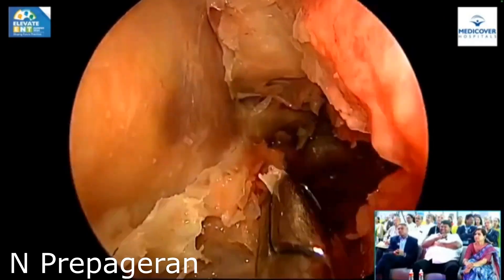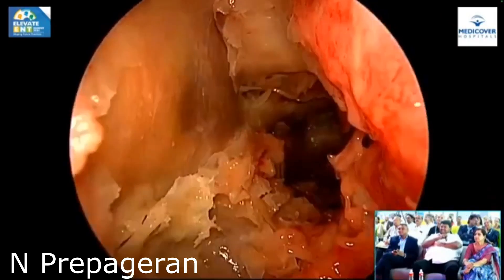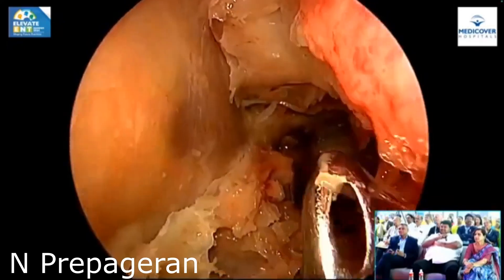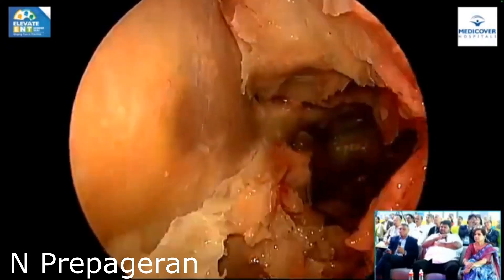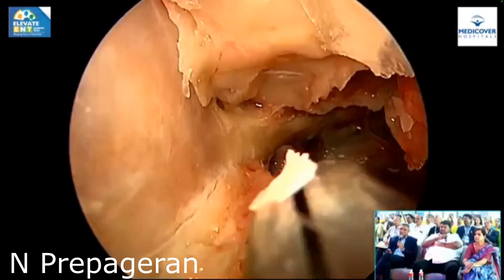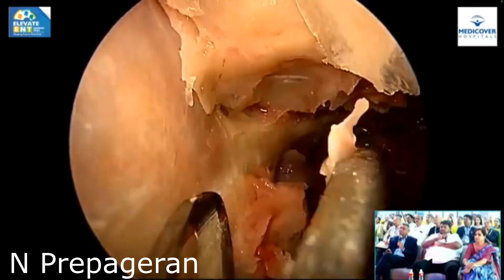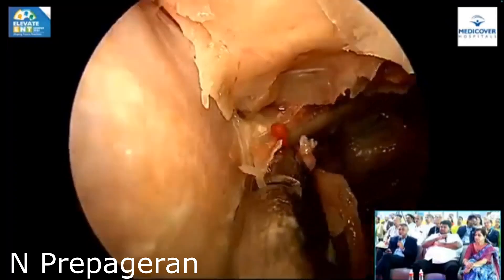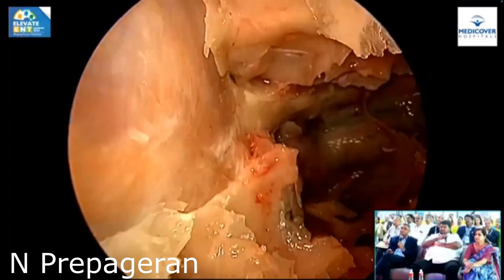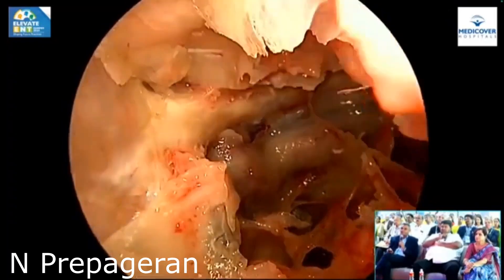Very good question: do you remove the perineural sheet of the optic nerve or not? If the compression is external — meaning a tumor that is compressing — this bone removal is enough, no need to open it. If your compression is internal, which means optic neuritis or something like that, yes, you open it. Okay good — now I'm happy. Can you see the optic nerve? Yes sir.